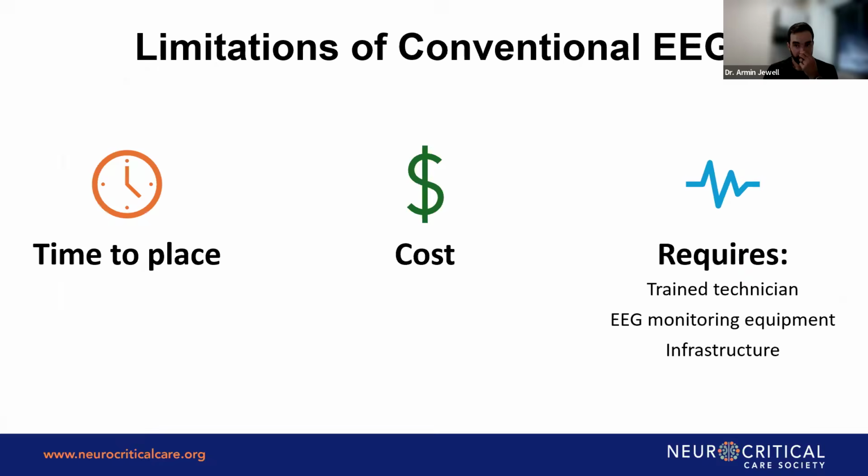Some of the main limitations that came up were time. As you can imagine, with the number of electrodes, time is needed to measure and place them accurately, depending on the tech's abilities, of course, but it is still a time requirement.